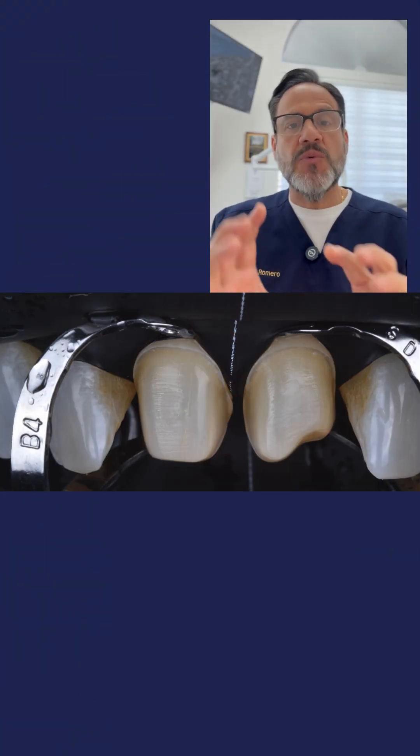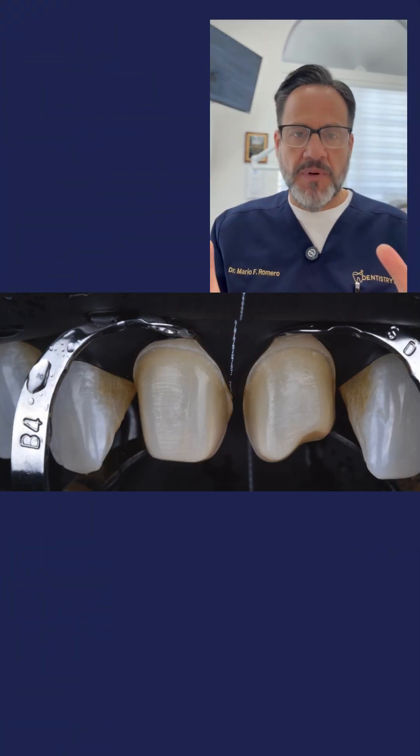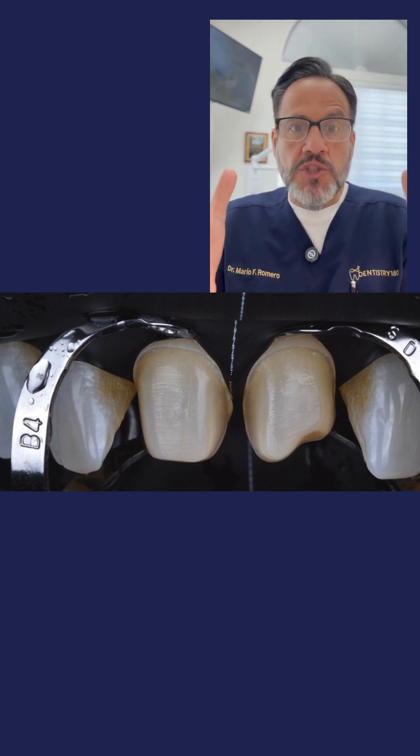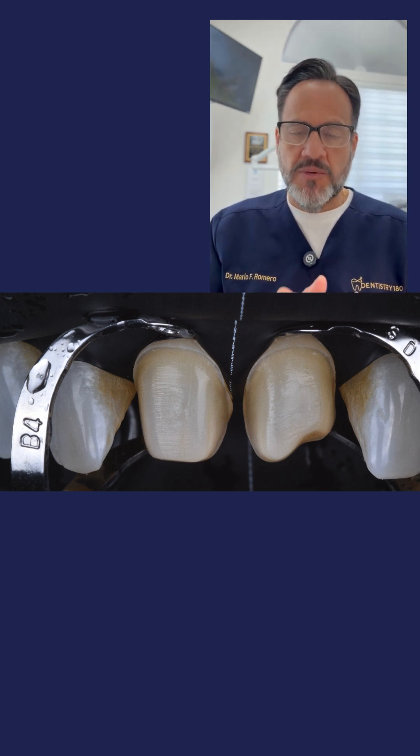Is rubber dam really the best? To answer this question, let's jump into photo number one. In photo number one, I've already isolated these two beautiful preparations on teeth eight and nine, where I'm going to be able to deliver, under a very well-controlled environment, two ceramic restorations.